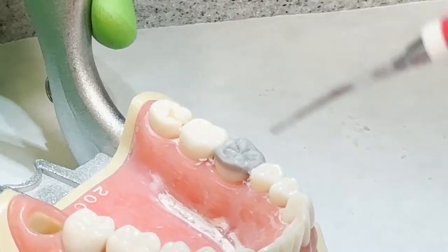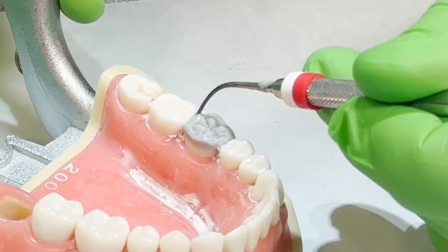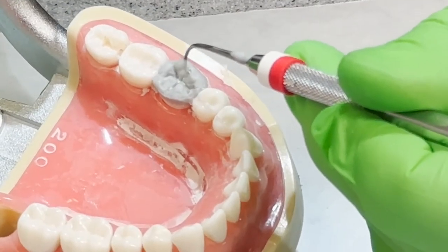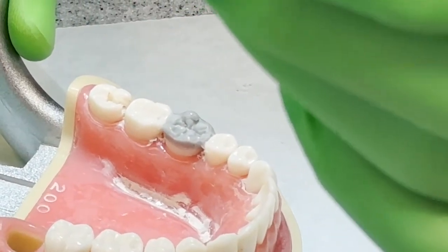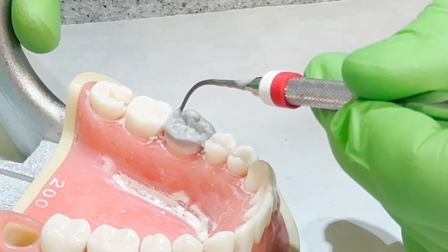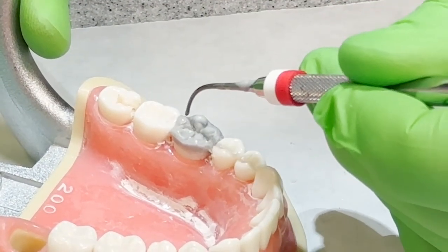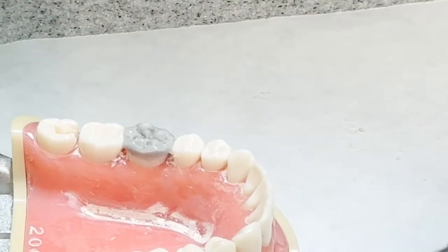I want that distal cusp to be a little more prominent than what I have, so I'm going to try to bring that in there again. I'll have to carve back some. But see how quick you can make that happen?